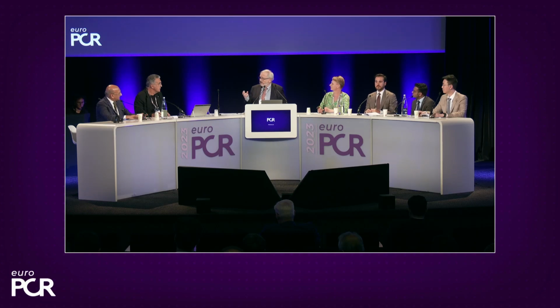So what is very interesting is that I didn't know that the lithotripsy, the shock wave, can destroy the sensor, but if you put the sensor far away in the circumflex, it will not happen. That's for me what I learned today at PCR, okay?